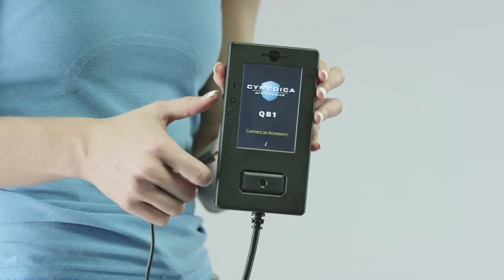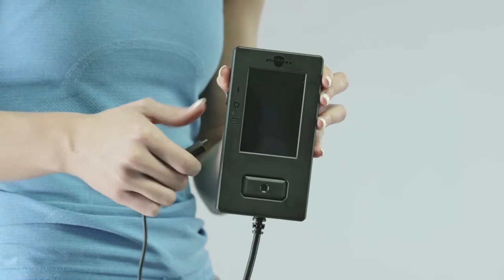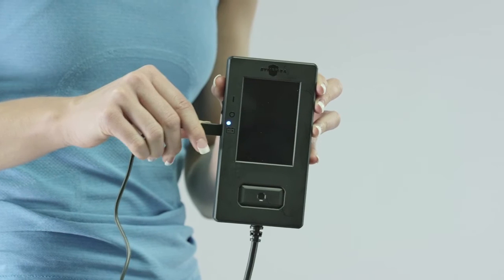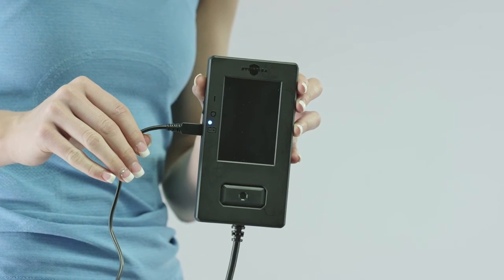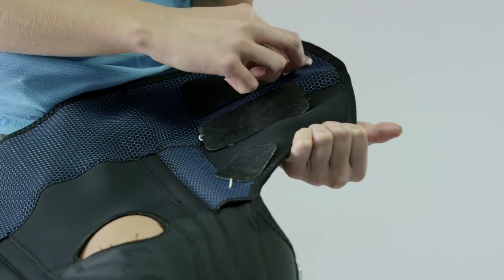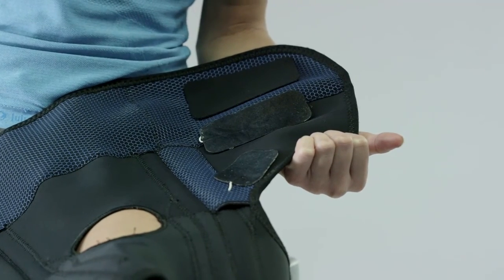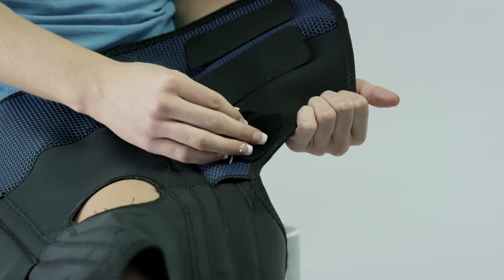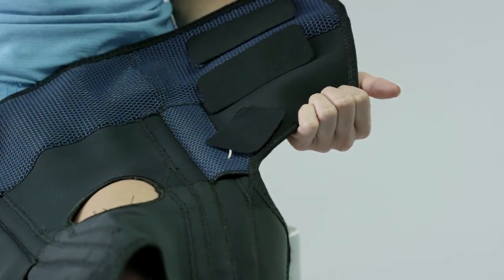Disconnect the user interface cable from the conductive garment by squeezing both sides of the cable connector and pulling away. To charge the user interface, make sure that the on-off switch is in the off position. Charge the user interface by plugging in the micro-USB connector of the wall charger to the micro-USB port. Plug in the wall charger. A blue LED light should be seen by the battery icon on the user interface to indicate that the battery is charging and should turn off when the charging is fully complete. Make sure to reattach the electrode covers to the electrodes after treatment is complete to keep the electrode hydrogel surface hydrated and tacky. The electrodes should last for many uses before they become dried out and need to be replaced.